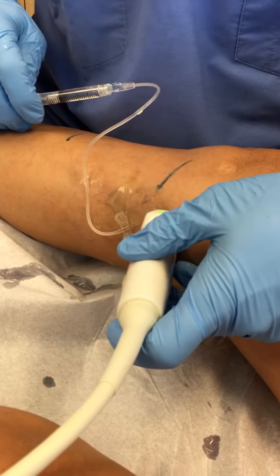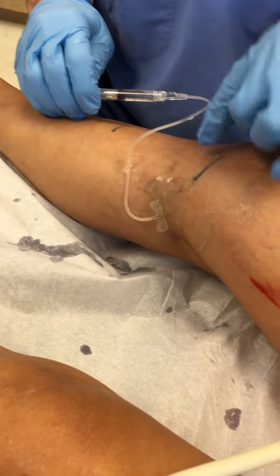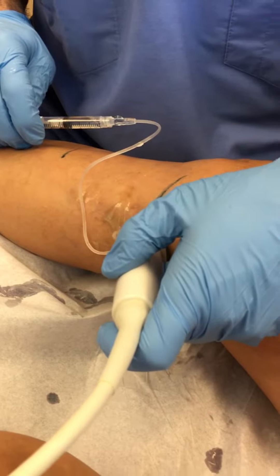We're just extending our treatment down the vein, because the reflux starts here and goes down, and then we're just going to treat it all the way down, see if we can't get it closed. That way we can get these little kind of areas here where you've got some bruisey looking things going on. We'll get these treated.